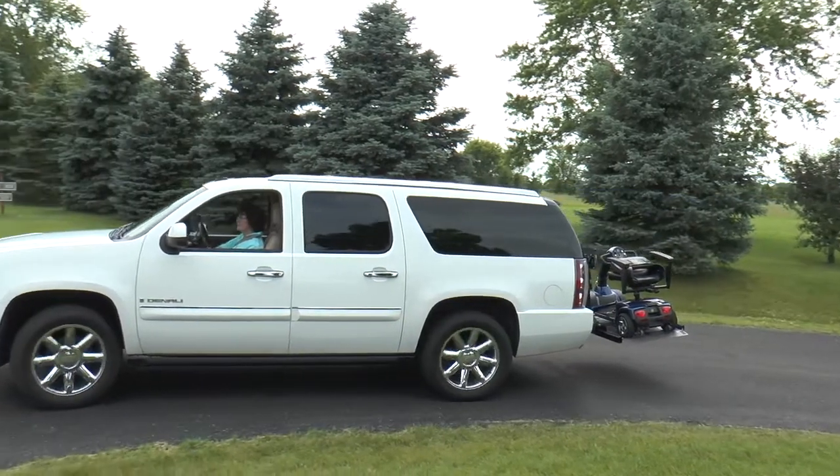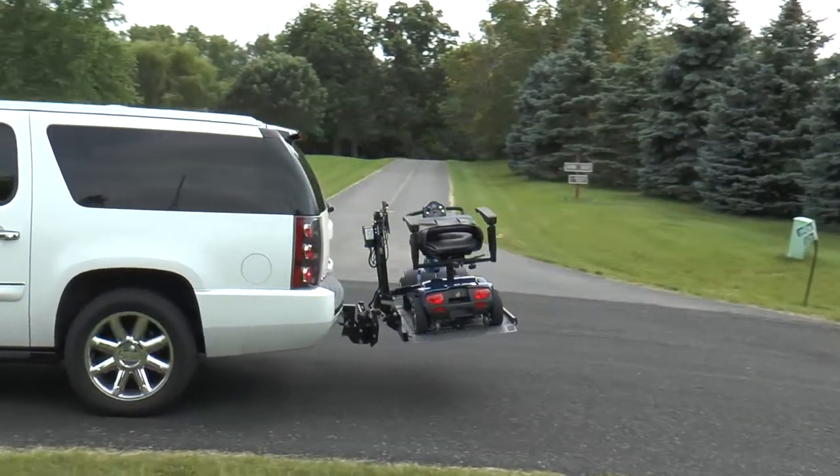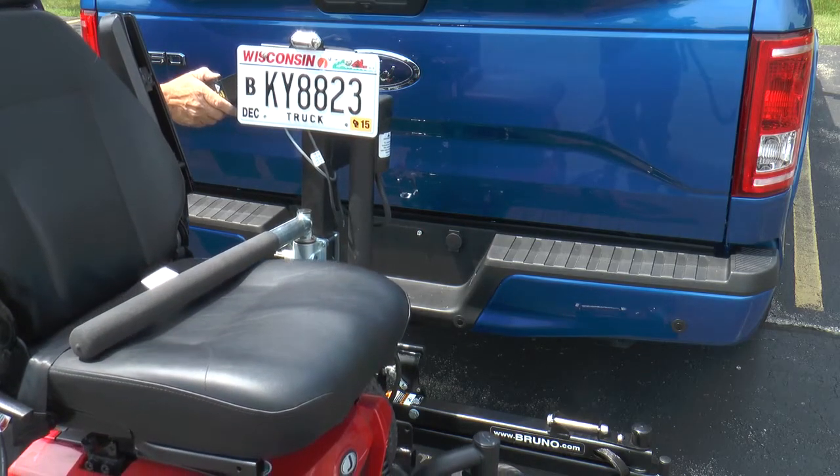Transport your scooter or power chair easily and safely behind your vehicle using Bruno's popular Outsider. With a variety of platforms and securement solutions, there's an Outsider to fit most vehicles and mobility devices.